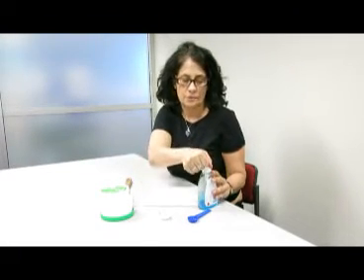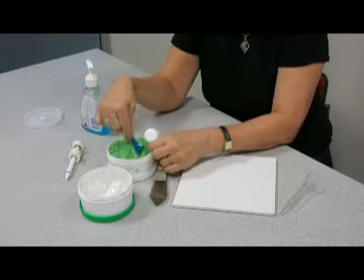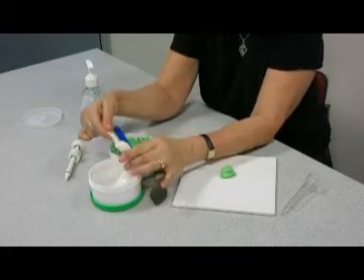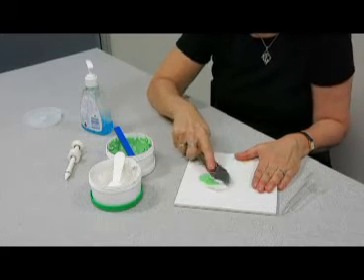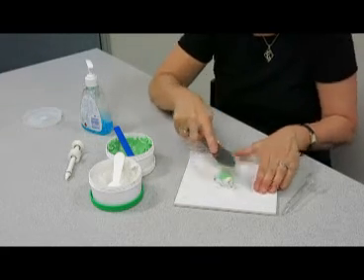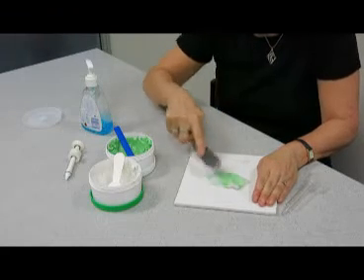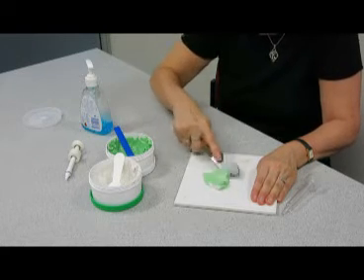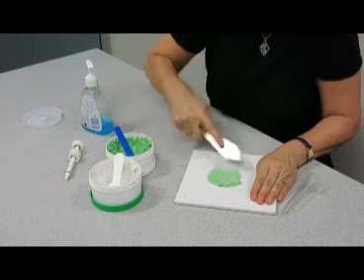First thing I do is I clean my hands with either soapy water or hand cleaner. So now I'm going to take one part of the colored mixture, the impression material, and one part of the white part of the impression material. Mix it thoroughly. One part is the catalyst which hardens the material. What we need to do is make sure there are no white bits, that it's all blended in very well to be one color — in this case a light green. I just fold them over and over until I don't see any white bits.